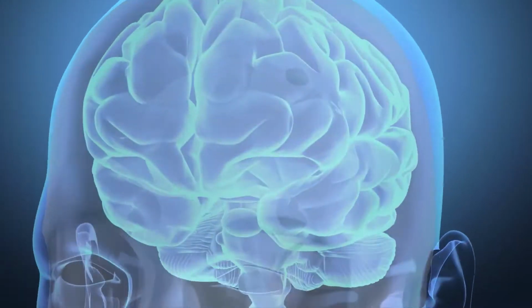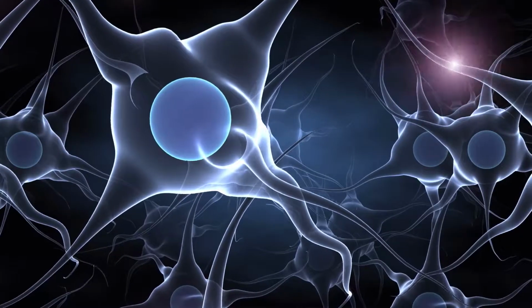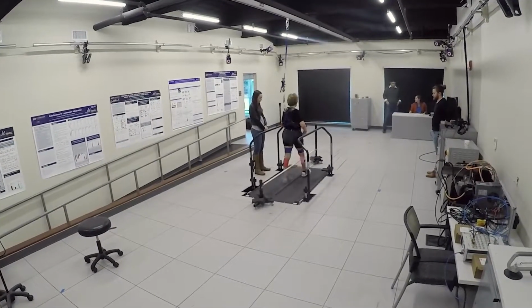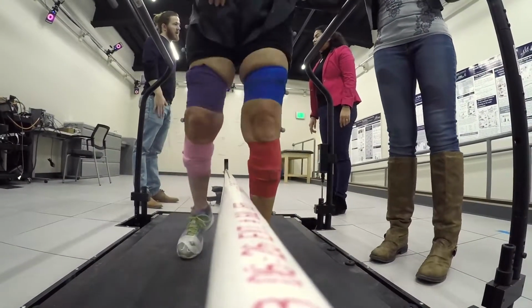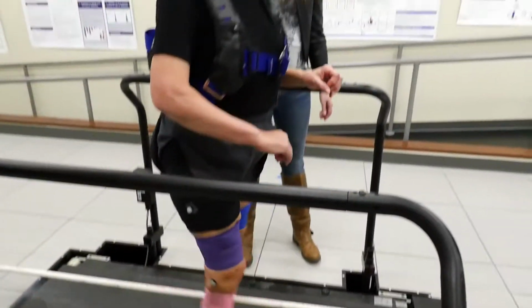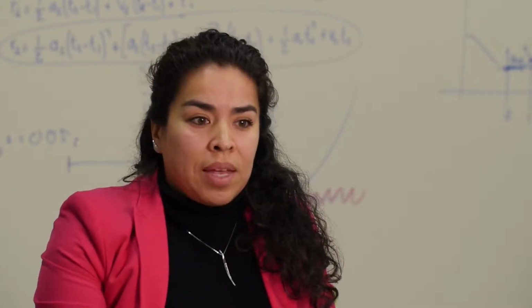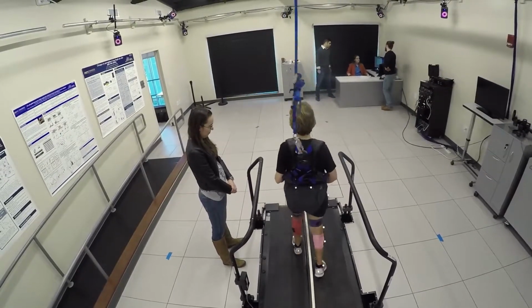It's a quirk in the way we learn. Walking on a split belt treadmill is an unusual enough experience that the mind classifies it as a novelty. Test subjects can learn to adjust their movements while they're on it, but once they get off, old gait patterns creep back in. We're very interested in understanding what are the factors that determine that specificity in the learning, and can we manipulate them? Can we make patients carry over more of the learning that they acquire to their real lives?